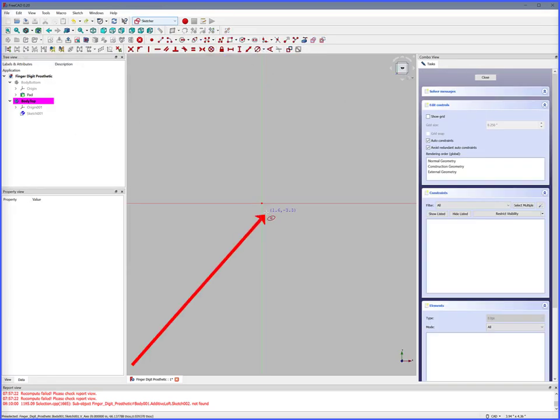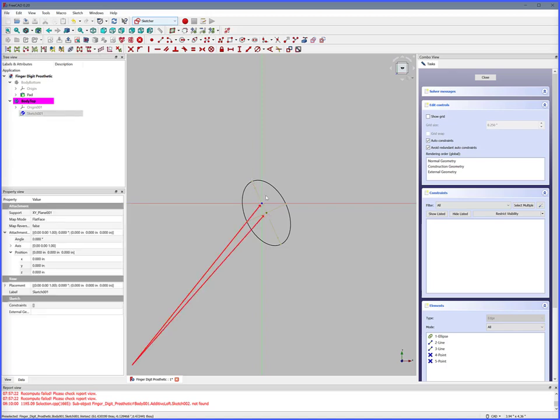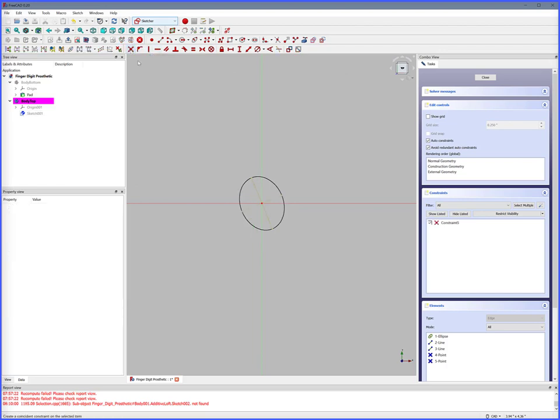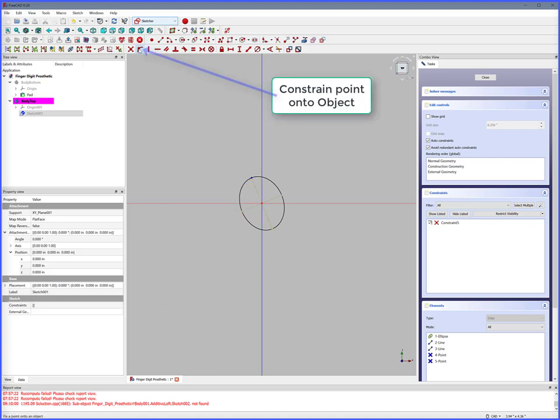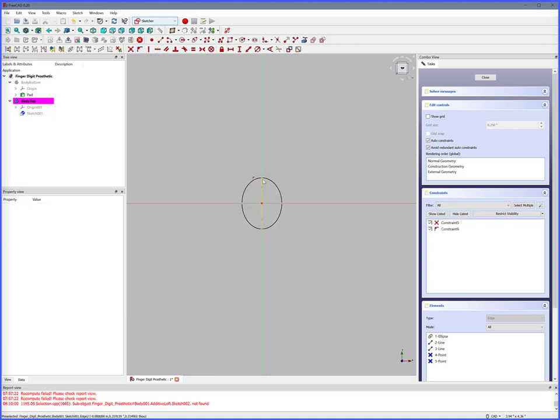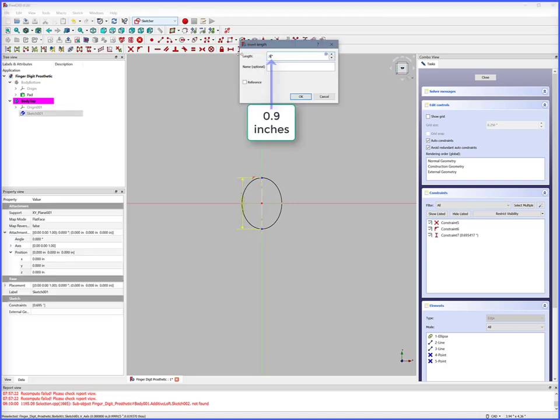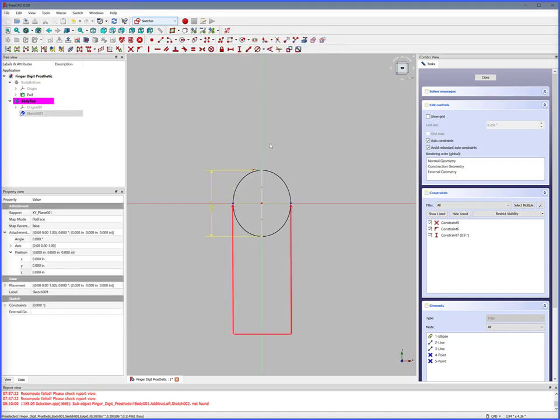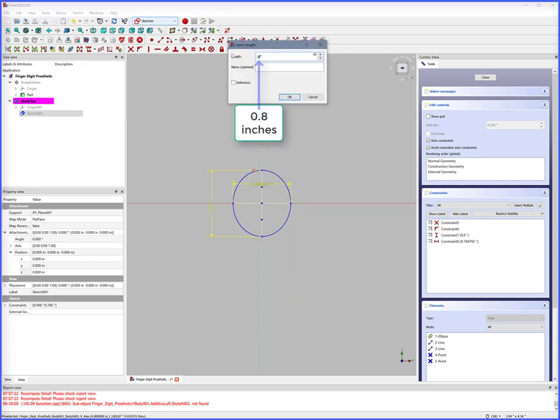Ellipse by center, click, double click to complete, right click to release. Select XY center, select center of ellipse, Constrain Coincident — it is now centered. Select ellipse point, select Y axis, Constrain Point Onto Object — now it is symmetrical. Select Y max points, Constrain Vertical Distance — outside Y diameter is 0.9 inches. Select X max points, Constrain Horizontal Distance — cylinder outside X diameter is 0.8 inches.